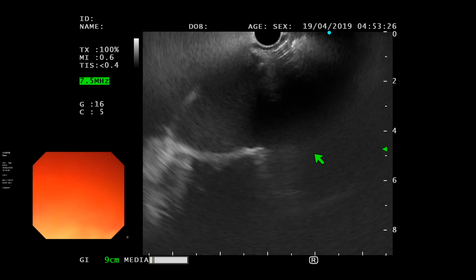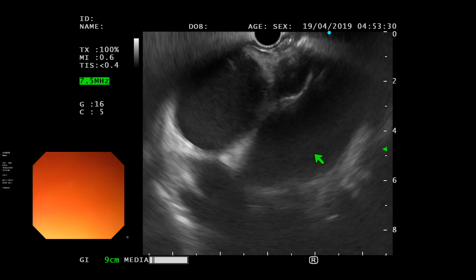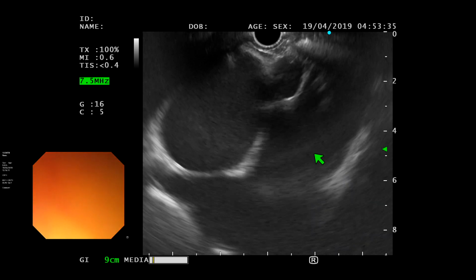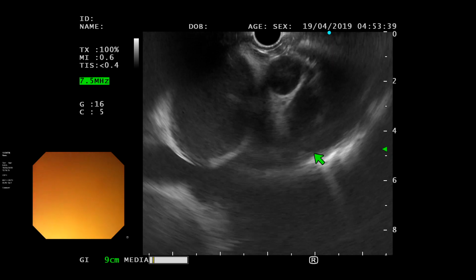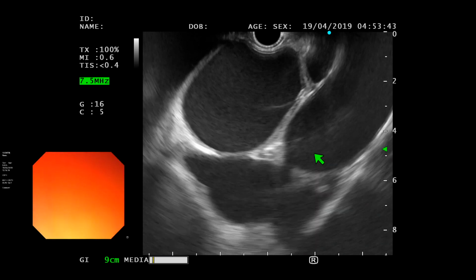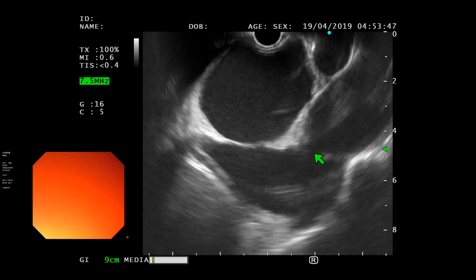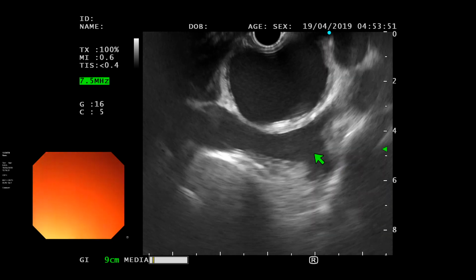And you can see, at this point, the left ventricle will go into the aorta there. Okay? Left atrium, left ventricle, aorta going out. Now, once you have seen this, you will proceed a touch further. So there is a bend coming in here, so hold your scope. Very slight and gentle push. We're going forward.